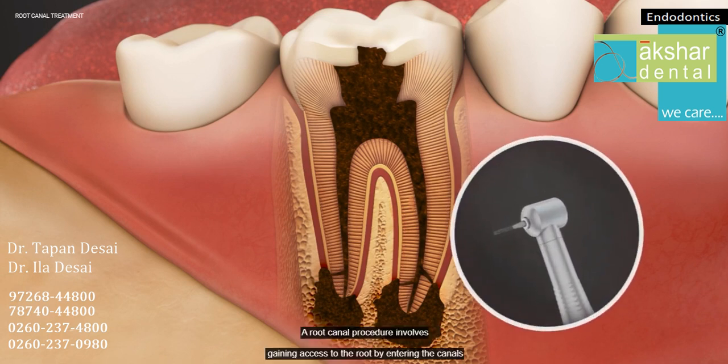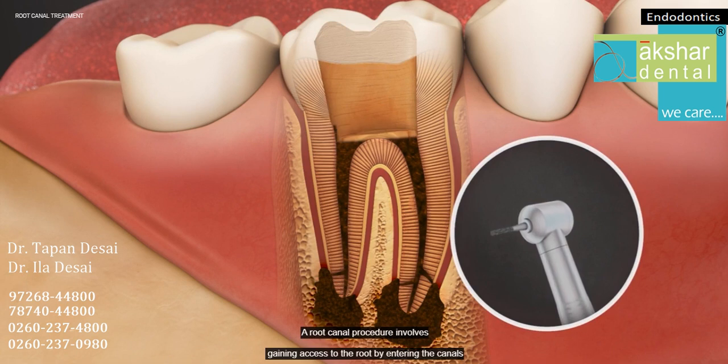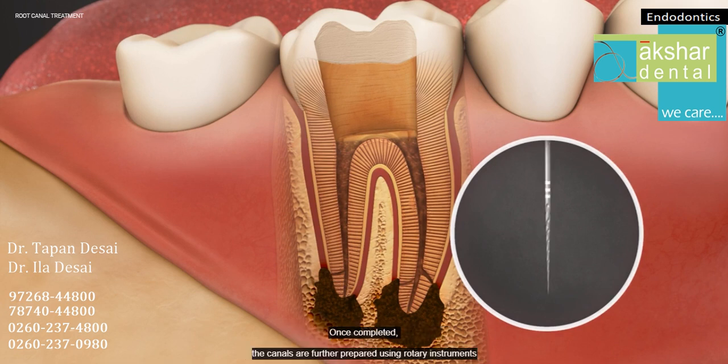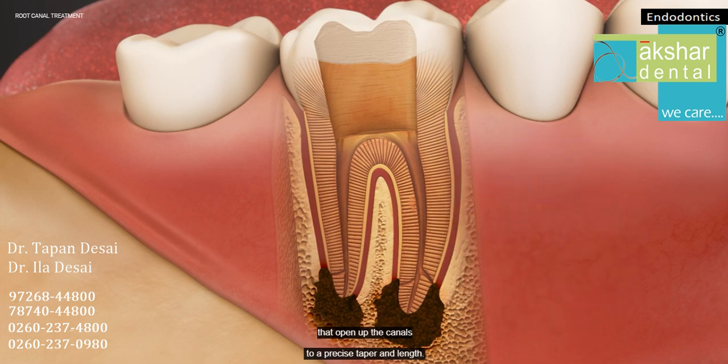A root canal procedure involves gaining access to the root by entering the canals from the crown of the affected tooth and removing all of the decayed tissue. Each tiny canal is then identified, cleaned, and disinfected using small, narrow instruments called files. Once completed, the canals are further prepared using rotary instruments that open up the canals to a precise taper and length. A flexible plastic material called gutta percha is then used to fill each canal, sealing it and protecting it from damaging bacteria.